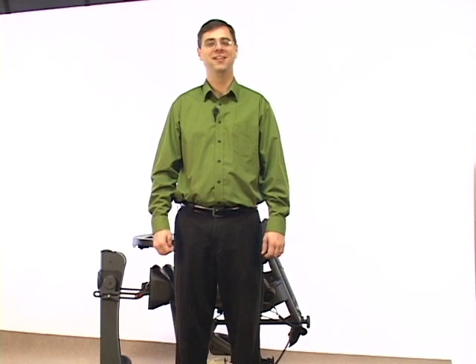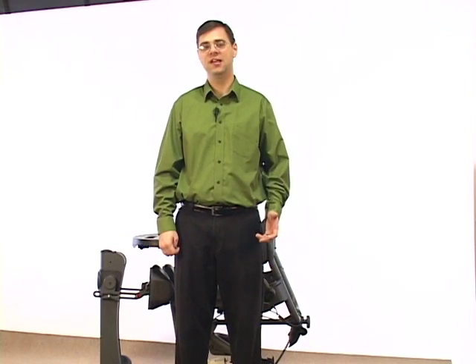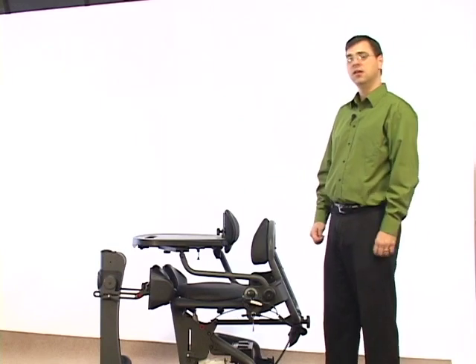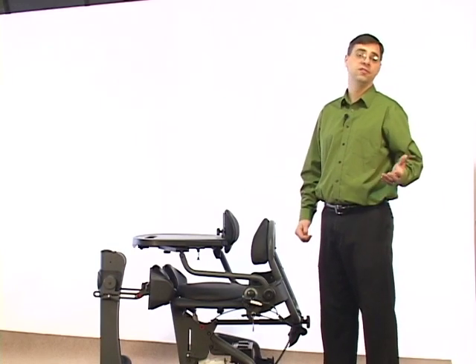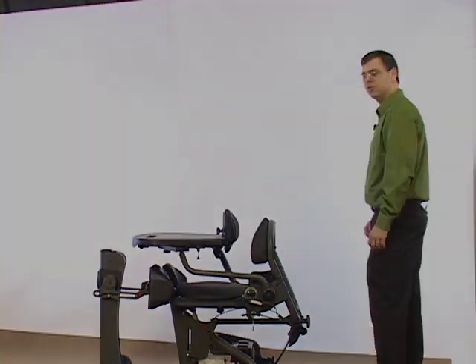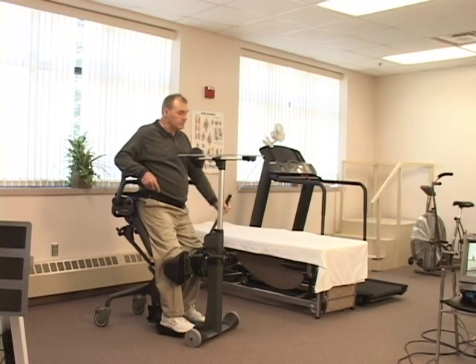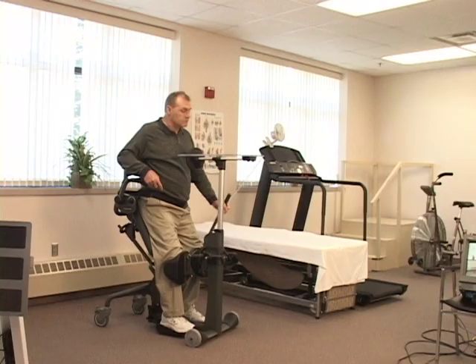Hello, my name is Andrew Gardine and today we're going to take a look at the Easy Stand Evolve, including making the proper adjustments and fitting it either for one client or for many clients. It's important to know these adjustments well so that our clients get the maximum benefit out of either sitting or standing in the Easy Stand.